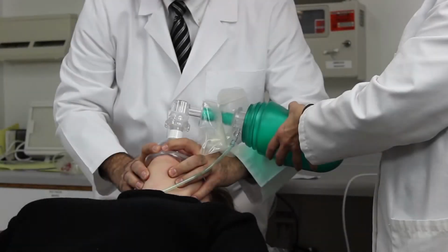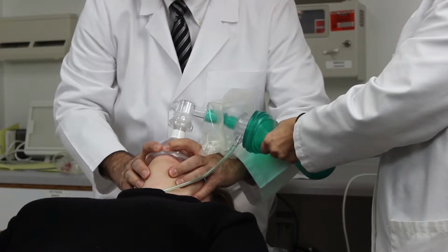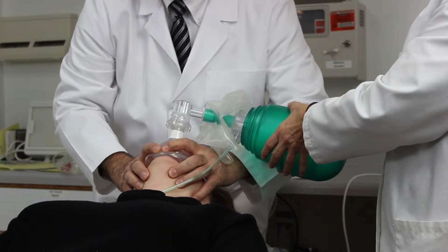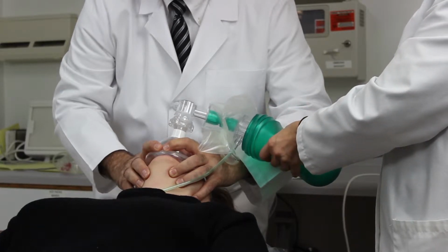One person places a hand on each side of the mask, obtains a good seal around the patient's nose and mouth, and the second person squeezes the bag. If we're not able to ventilate the patient, that is, we're not able to breathe for the patient so that we see a good rise of the chest with each breath, we might consider an oral airway.